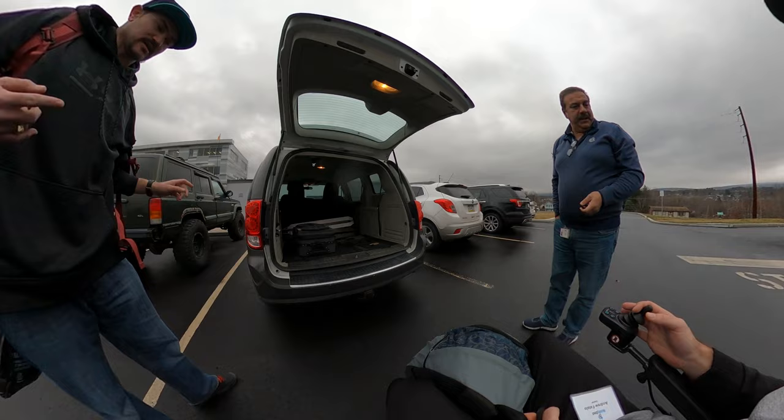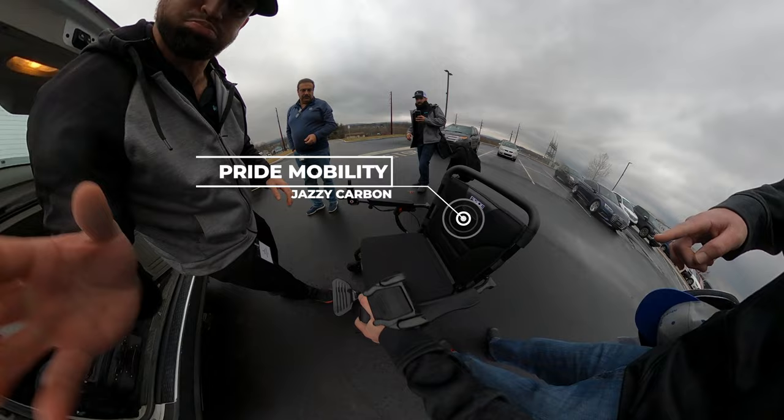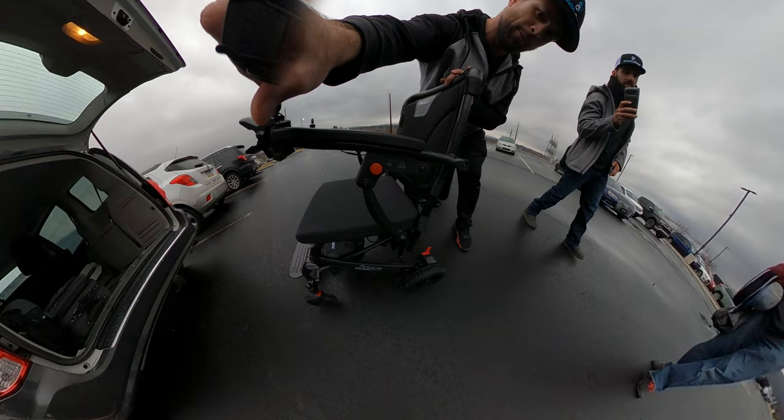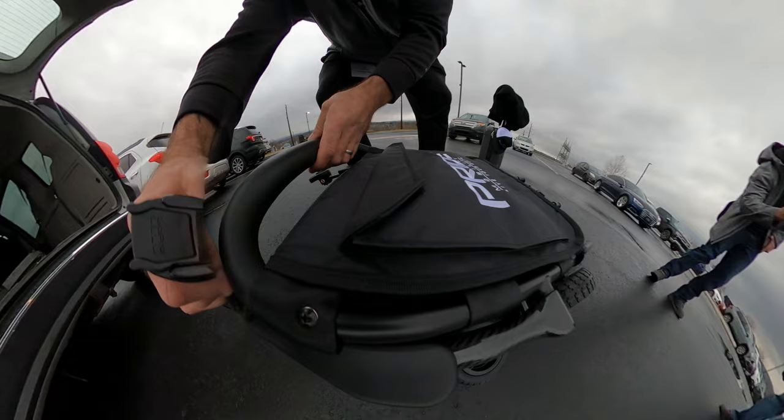All right, so again, this is the Pride Mobility Jazzy Carbon, and it transports really easy. No. I'm gonna film you folding it. 360. Don't mess up the shot. You're messing up the shot. So as Dustin was going to touch, I'm just going to swing this back here. And on the back side of the chair, which he might have wanted to show, but it's okay. I'm just gonna fold it. We're not showing you about the chair, we're just showing you how to travel with it.